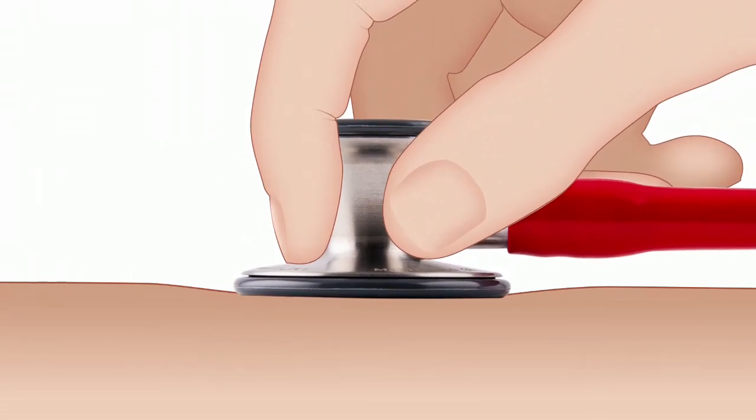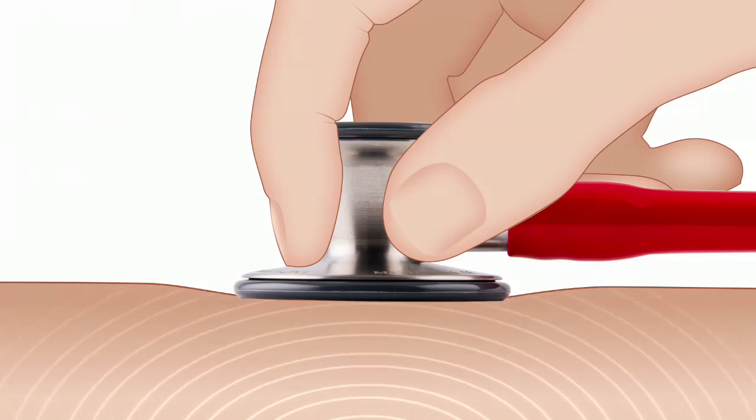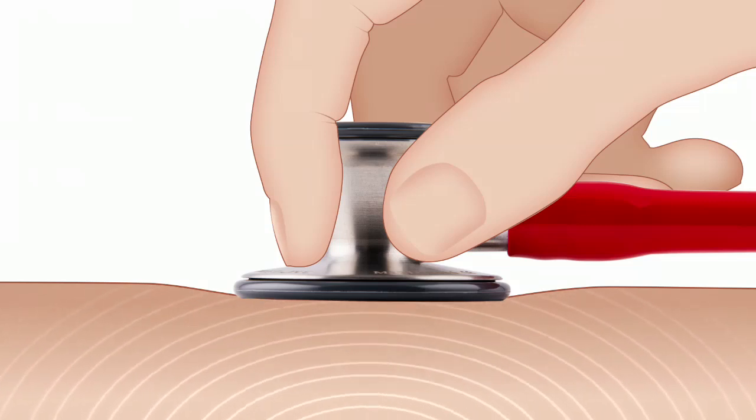The acoustic performance of your stethoscope can make a significant difference in your ability to detect, identify, and diagnose potential medical concerns.